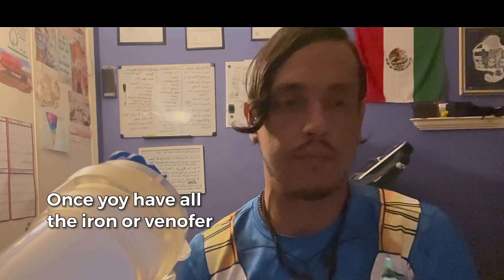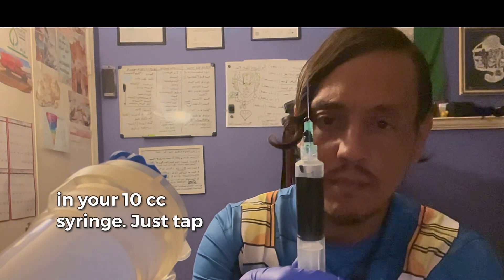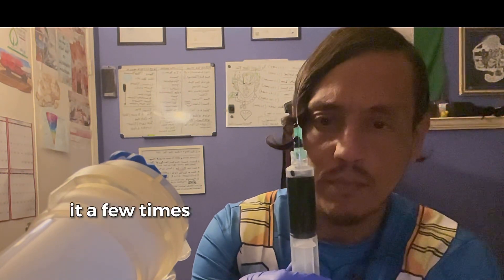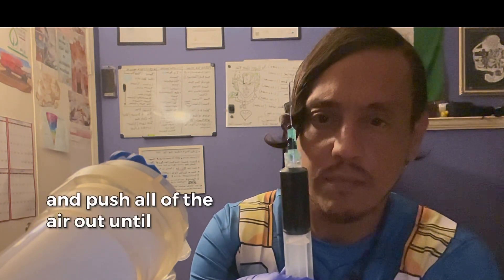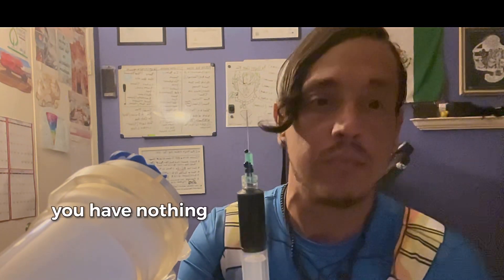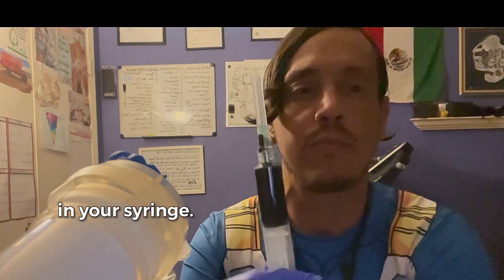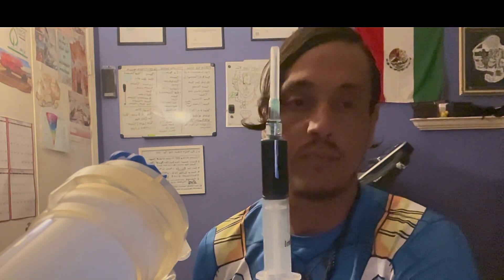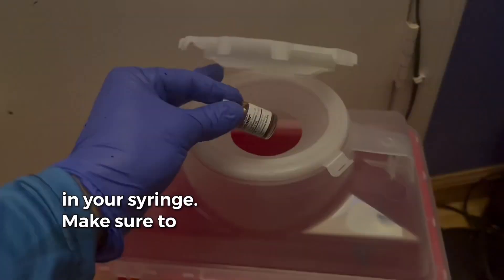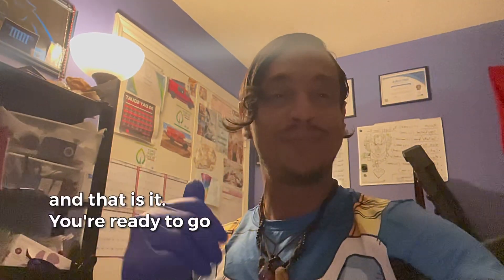Once you have all of the Venifer in your 10cc syringe, just tap it a few times and push all of the air out until you have nothing but iron in your syringe. Make sure to discard the needle in your Sharps container. And that is it.